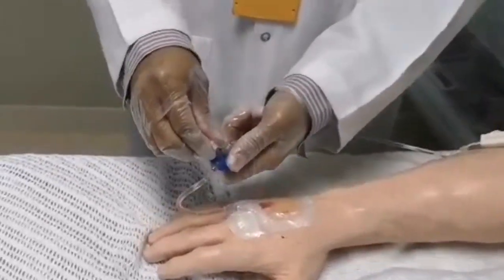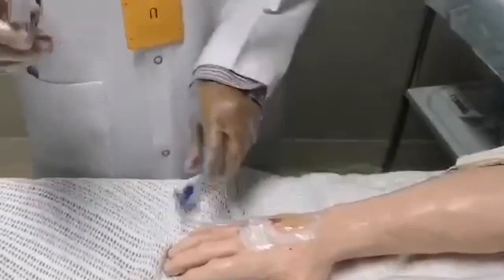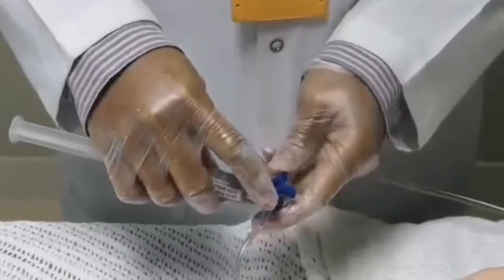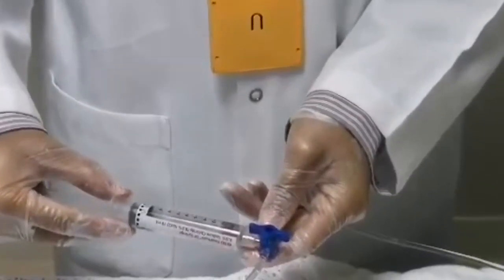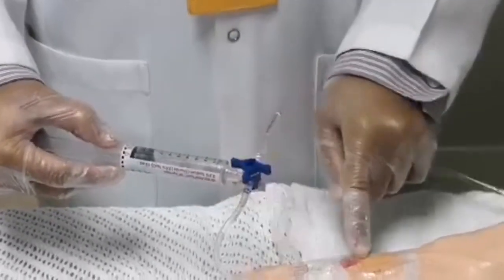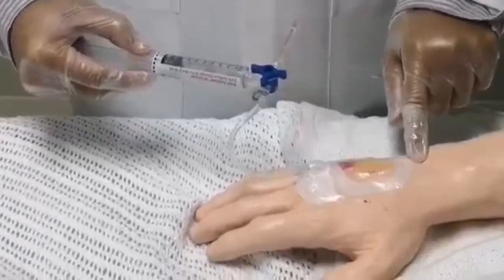Remove the cover, making sure that it is closed on this port. Clean the port and attach the flushing syringe on the injection port. Open the three-way saline lock, taking note that the arrows indicate the direction open towards the patient. Flush three to five ml of normal saline. The goal of the first flushing is to check for the patency and placement of the IV cannula, making sure that there is no redness, swelling, infiltration, phlebitis, or signs of extravasation at the insertion site.